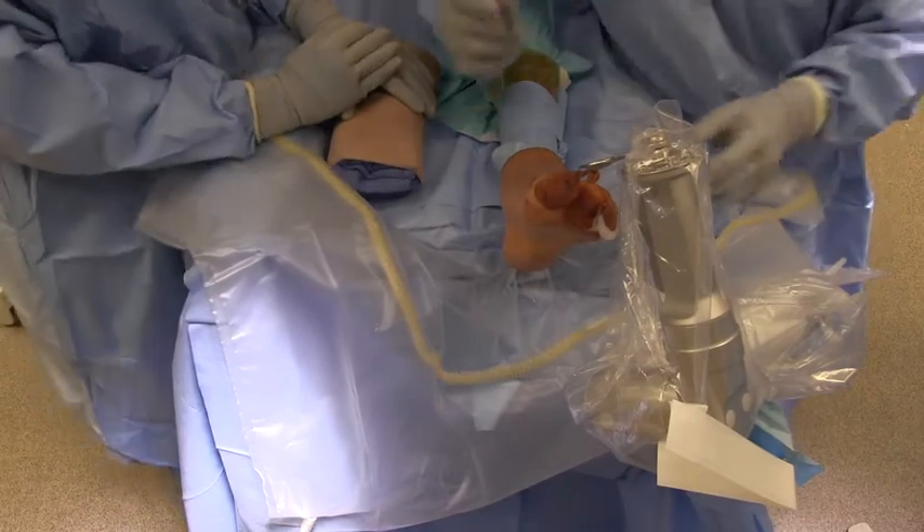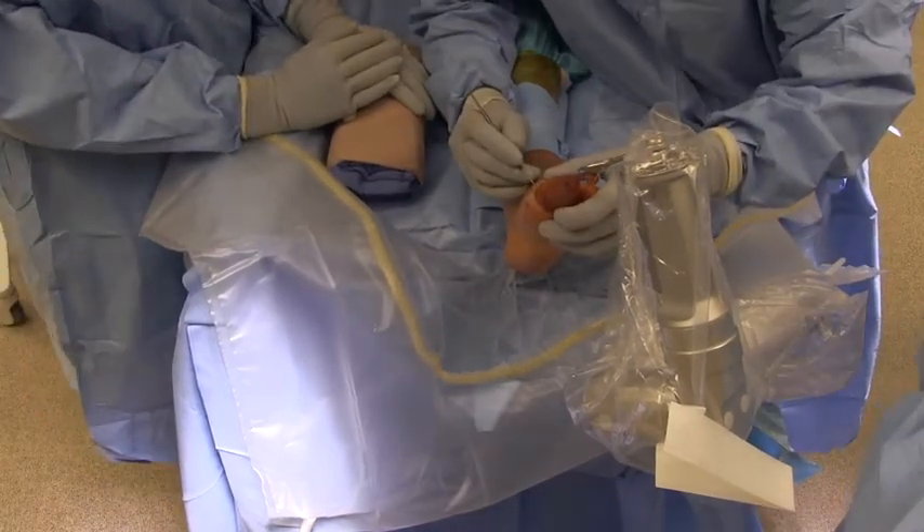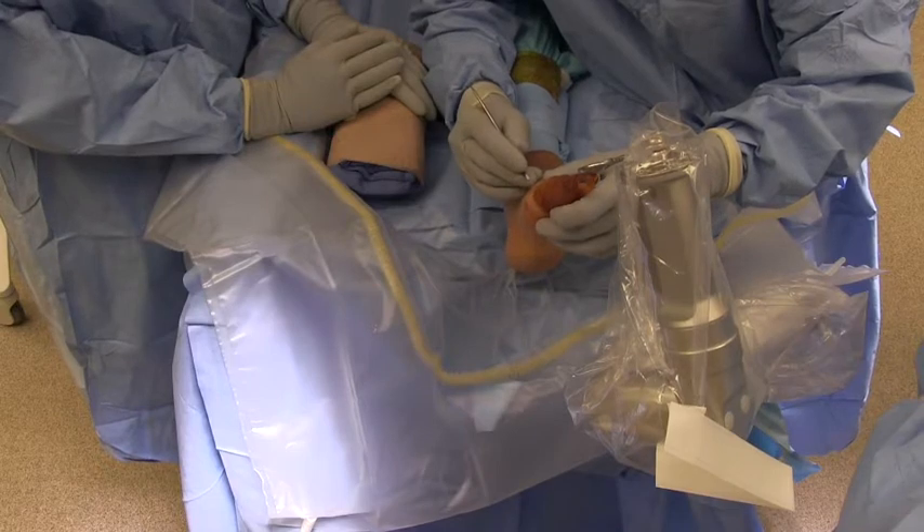A dorsal medial portal is made with a simple nick and spread technique, being cautious of the EHL tendon and the neurovascular bundle.